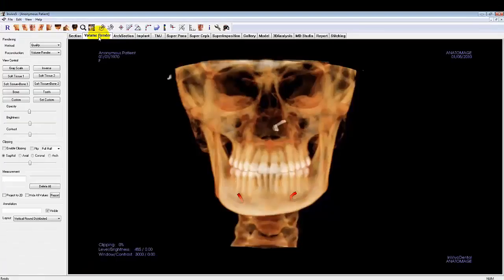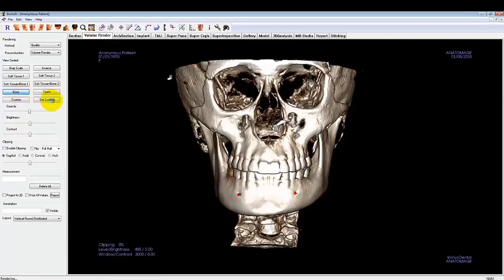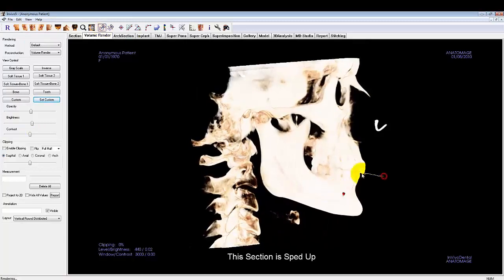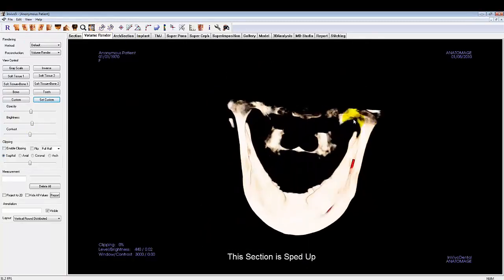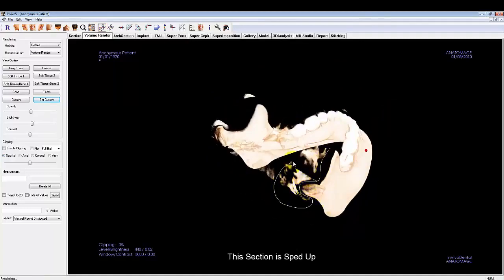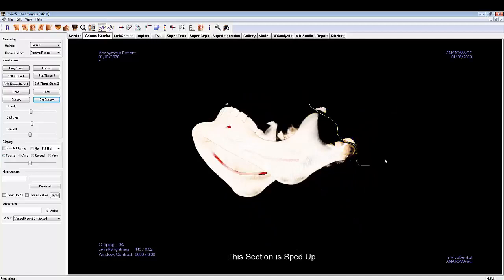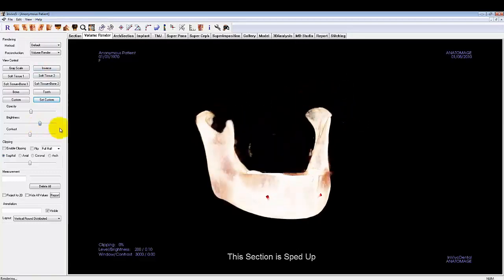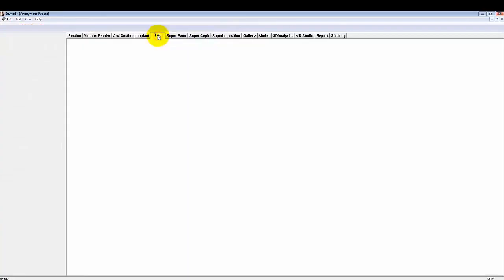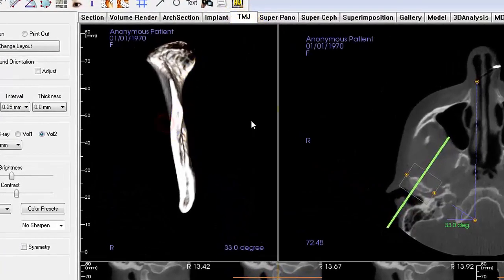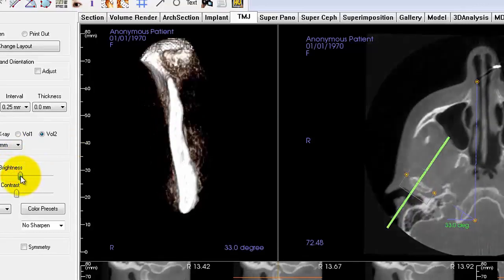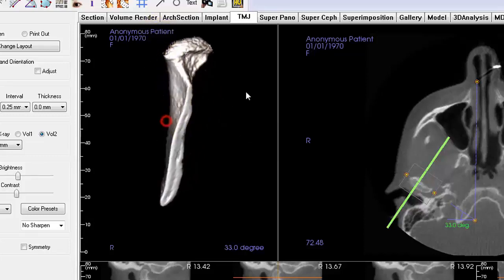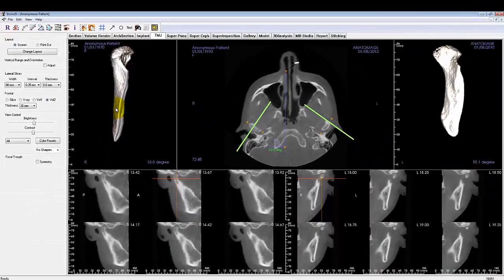I'll briefly demonstrate the process. As you can see, the sculpting done in the volume render tab was reflected in the TMJ tab, and the condyle is now isolated. That concludes the TMJ tab tutorial.